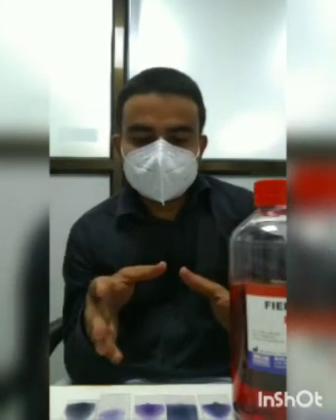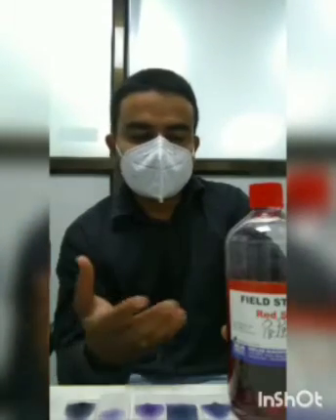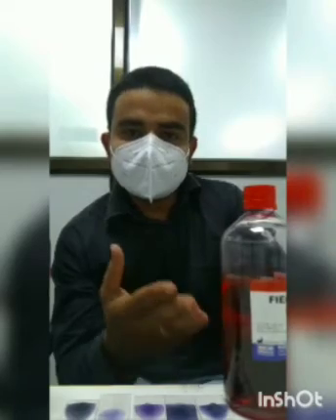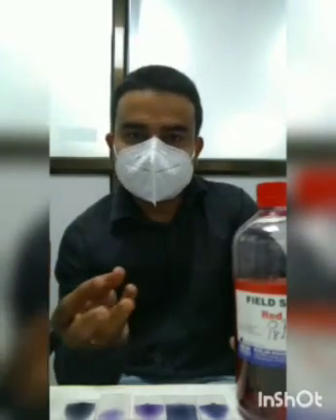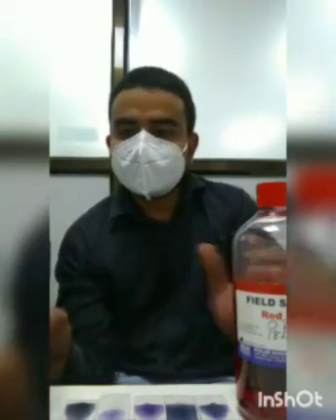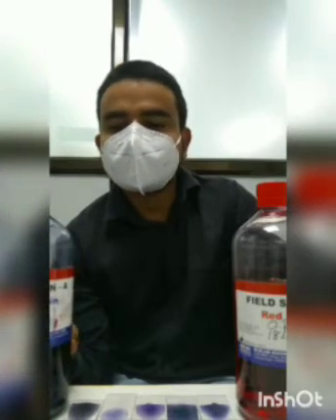Okay, of all these stains, what we are using commonly at our laboratory is the Field stain. Field stain contains two components. One is eosin Y, that is the acidic dye. This acidic dye will stain the basic components in the cell. The basic components are these granules in the cytoplasm, the endoplasmic reticulum, etc. And here is the Field A, that is methylene blue. The component of this Field A is methylene blue.